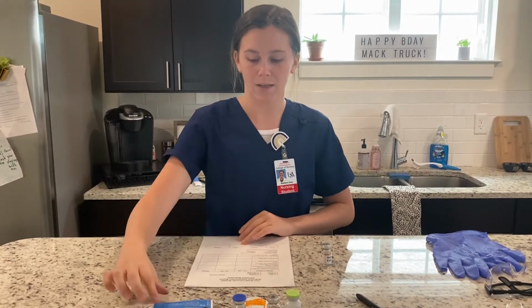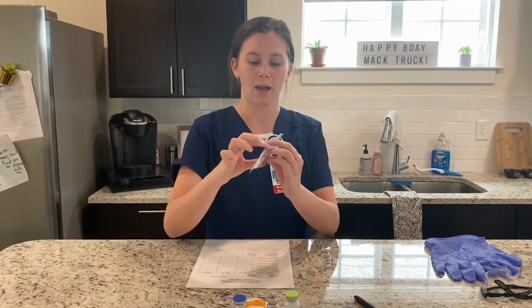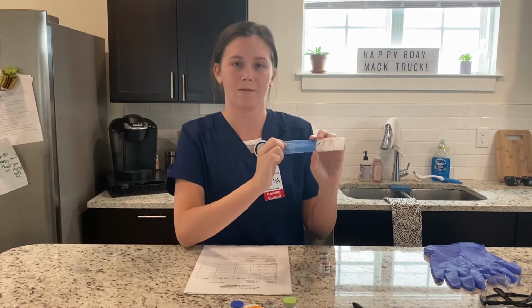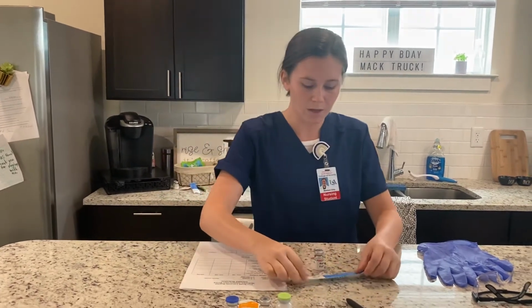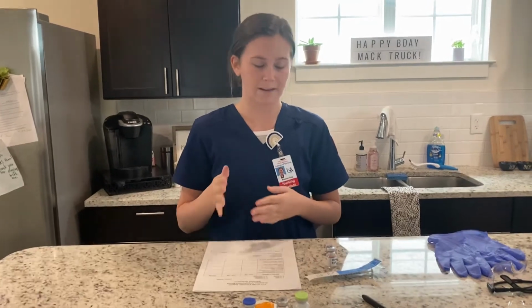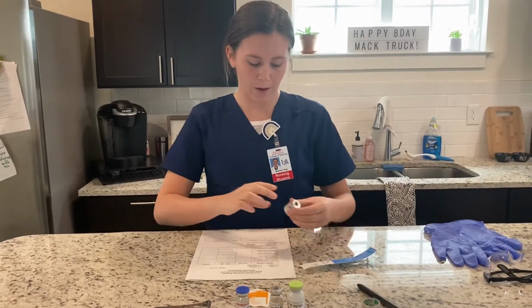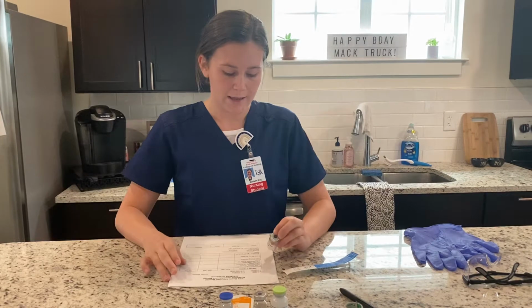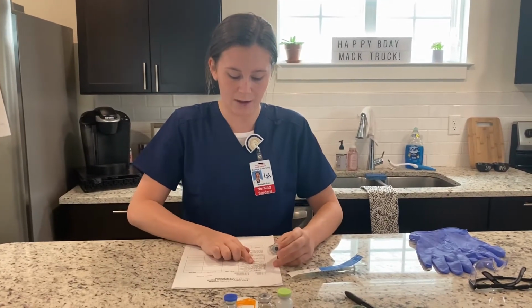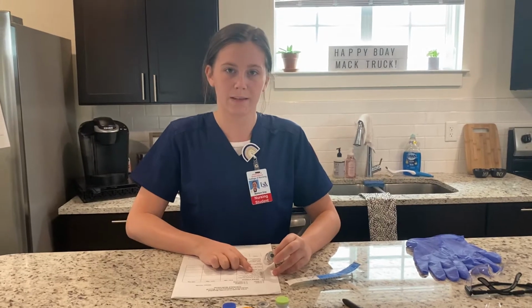And the right route is subcutaneously, so I'm going to be using a 1 milliliter TB syringe, 25 gauge needle. And I'm going to correctly identify my calculations before I begin. I see this vial is 10,000 units per milliliter, and the patient needs to receive 5,000 units, so he will be receiving 0.5 milliliters.